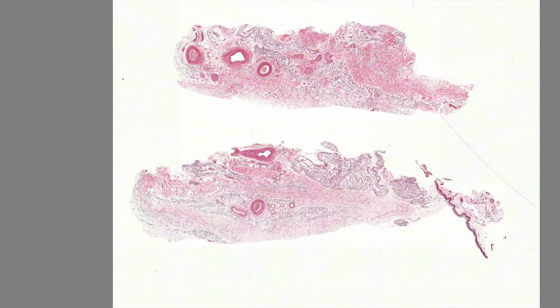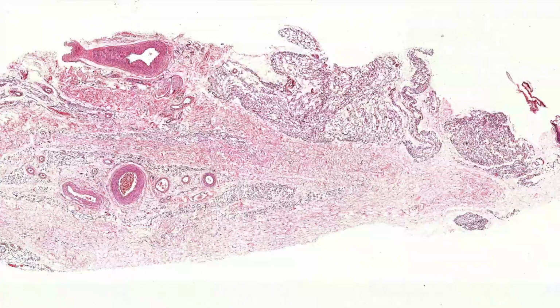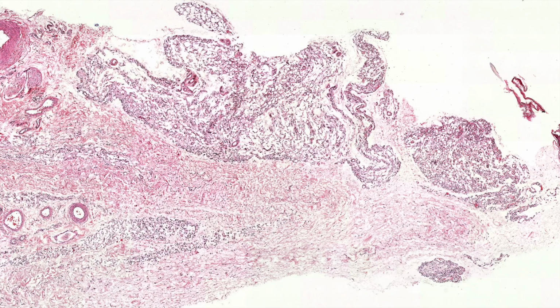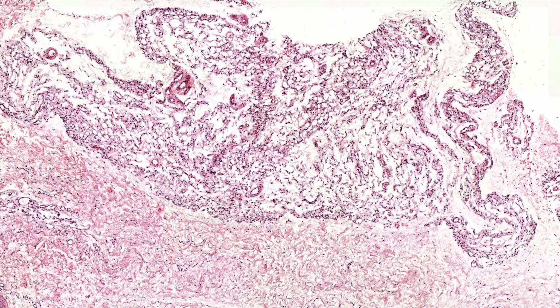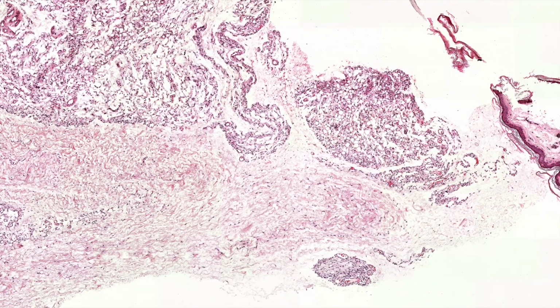I can take this one. You can see that there's adipose tissue here, but it's really small. It almost looks like, at least to me, like it's hypercellular because it's darker than you would expect. So absolutely, this is lipoatrophy. Very good. Lipoatrophy, or fat atrophy, and this is a very extreme example.